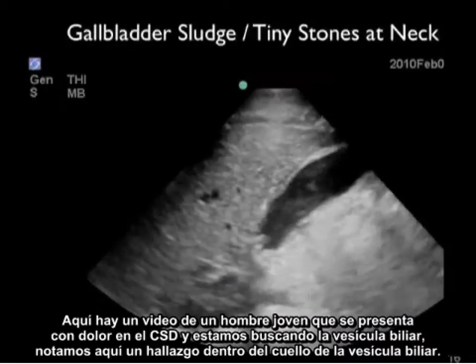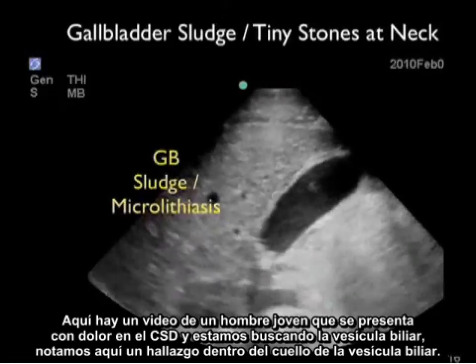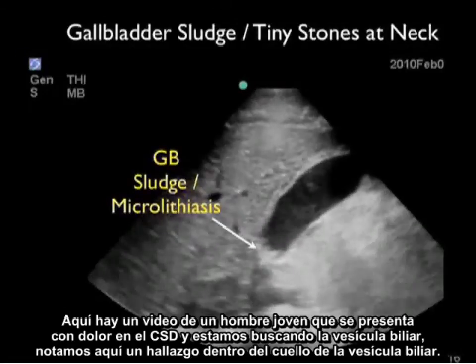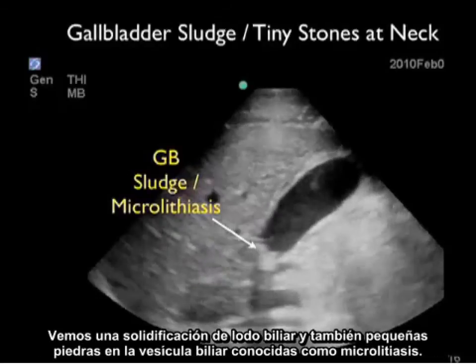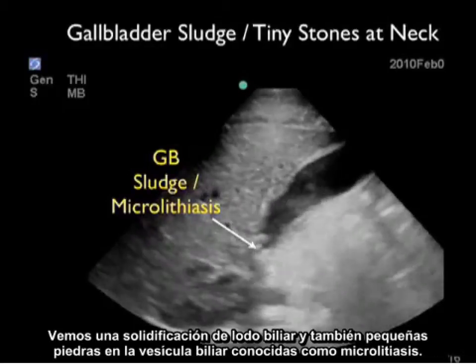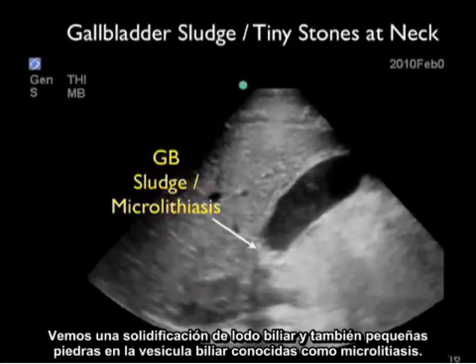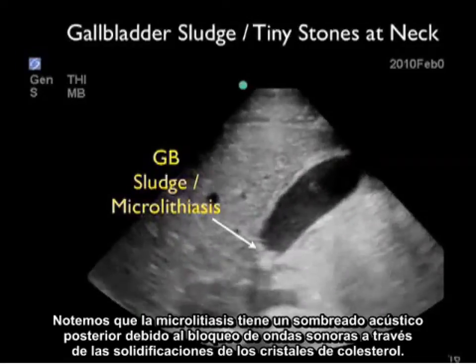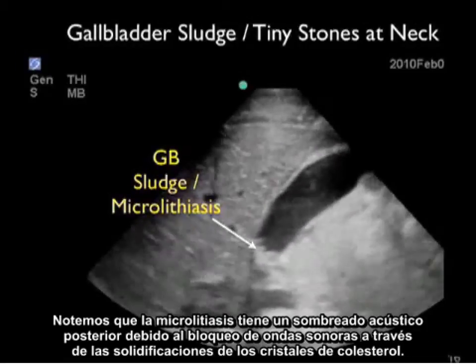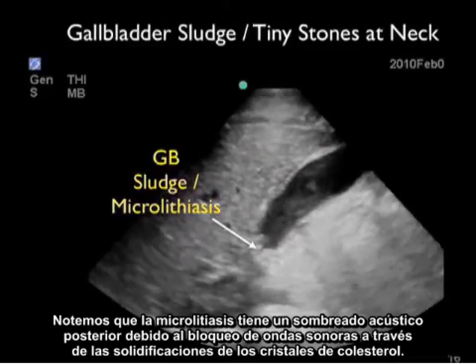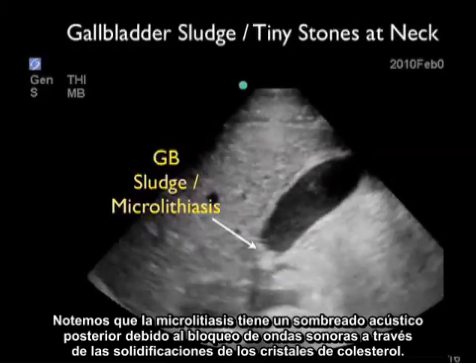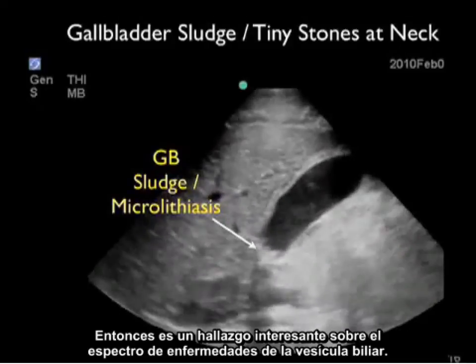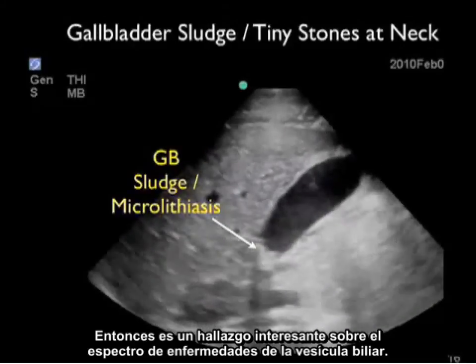Here's a video clip from a young male presenting with right upper quadrant pain. As we look through the gallbladder, we notice a finding within the neck — a concretion of gallbladder sludge and also tiny gallbladder stones known as microlithiasis. Notice that the microlithiasis has posterior acoustic shadowing due to the blocking of sound waves through the concretions of cholesterol crystals — an interesting finding on the spectrum of gallbladder disease.